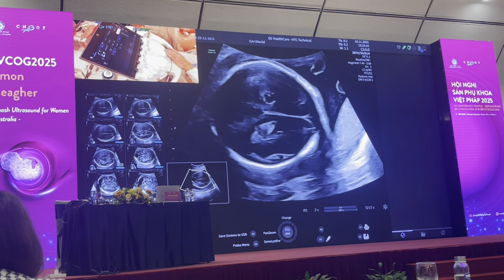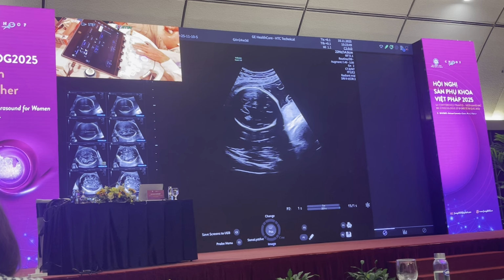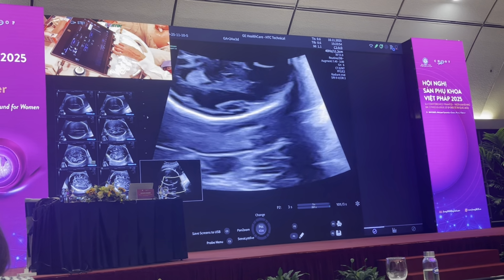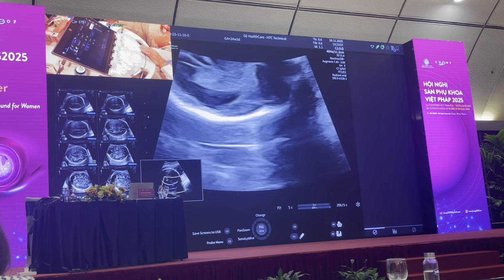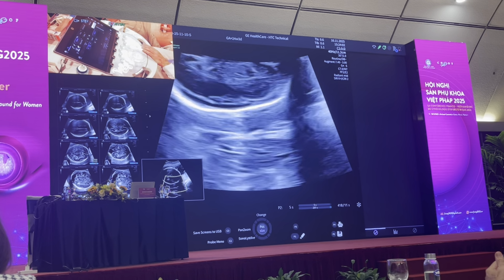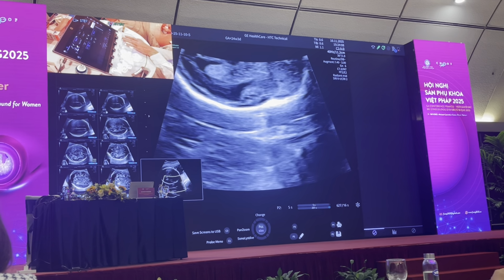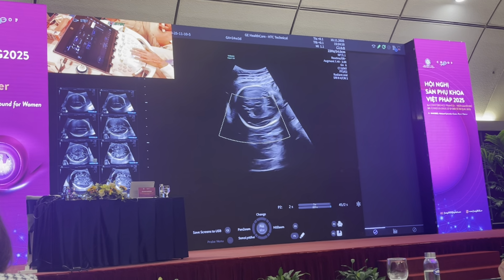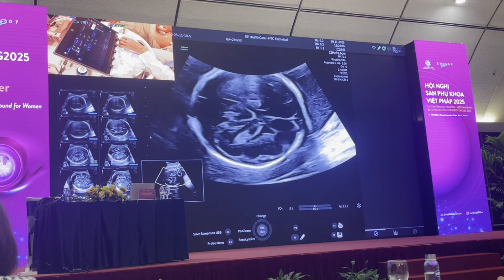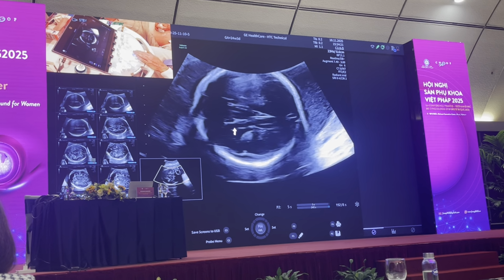When I'm looking at the Sylvian fissure, I'm saying, is it at right angles? So if I come down and evaluate the Sylvian fissure, remember I said I expect the Sylvian fissure to be about 90 degrees at 24 weeks of gestation. It is slightly less developed than I would expect, but again I will be dependent on an MR. It's a very borderline finding. The next I want to look at is the parieto-occipital fissure. So at this point here, I look at the level of the lateral ventricles, and I'm looking for outpouching coming out here to see the parieto-occipital.